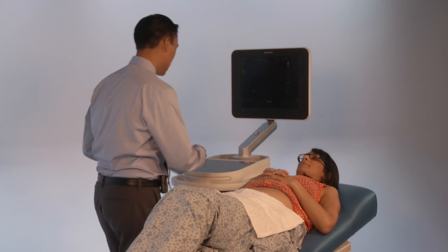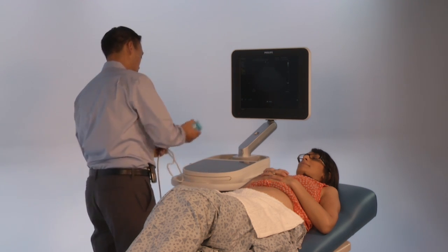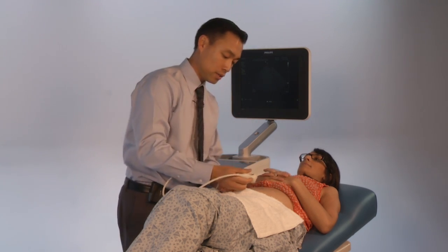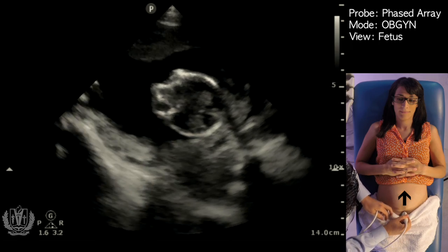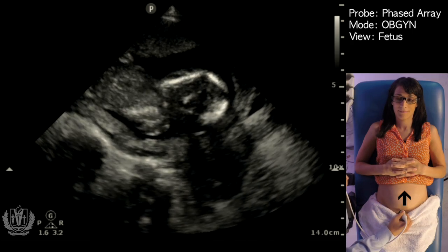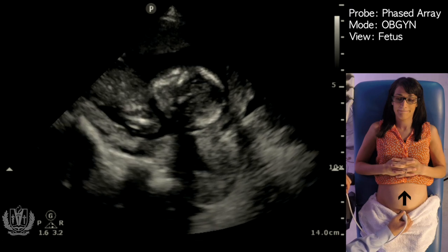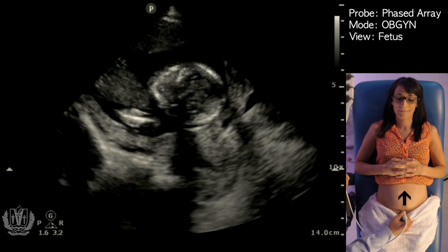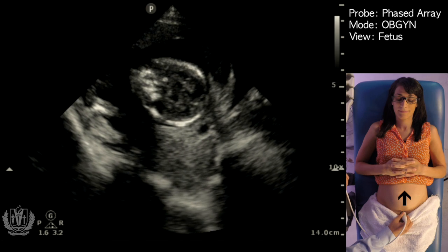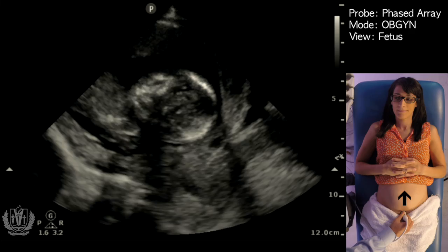I usually start with the sagittal view, going right down where the pubic bone is. On the screen, the things you're looking for include fetal presentation — specifically identification of the fetal head. Here we can see the fetal head in the center of the screen. We'll adjust and decrease the depth to bring that into focus.